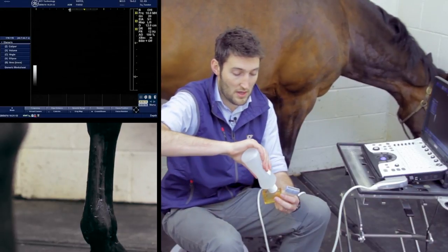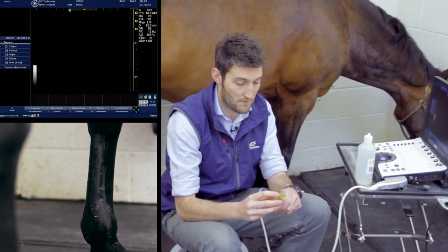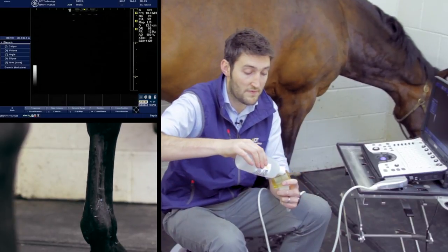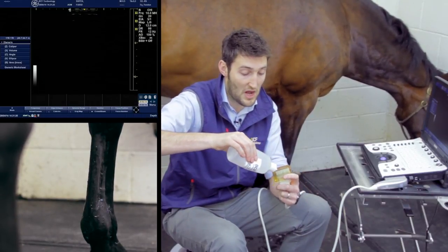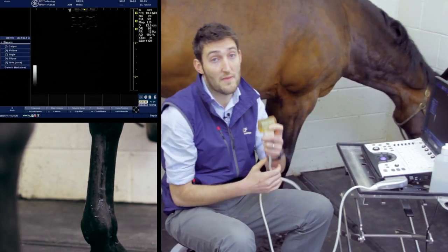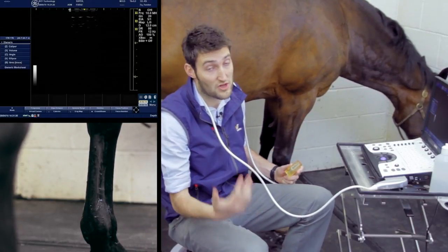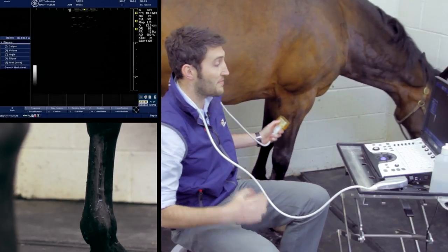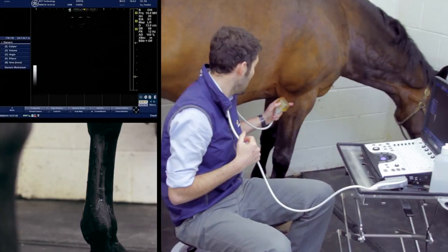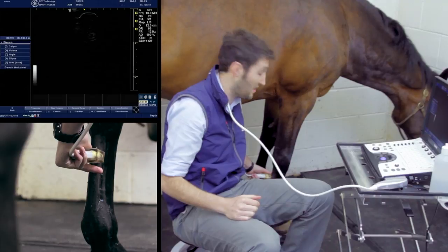If we're going to use a standoff, we need to put a little bit of gel into the standoff hole, then pop the probe into the standoff, and then put gel onto the end of the standoff as well. That gives us continuous contact between transducer, standoff, and skin. The leg has been clipped and cleaned, the gel has been soaking in for a while, and we should now be able to get a decent quality image. We're going to start off in transverse section.